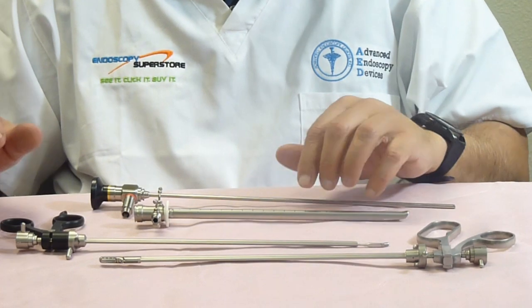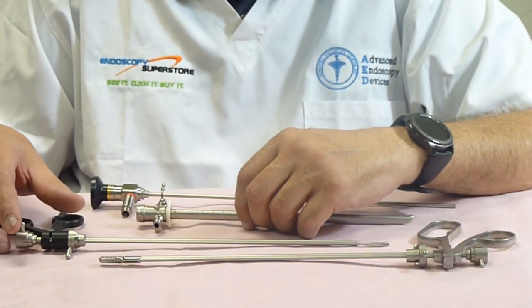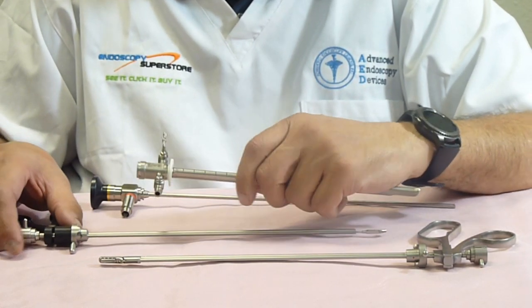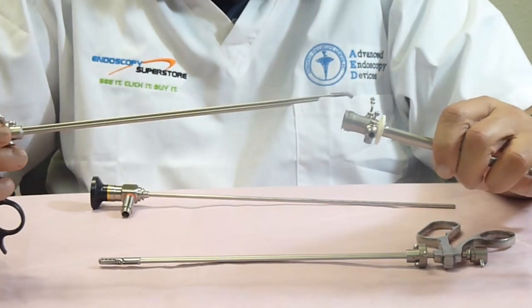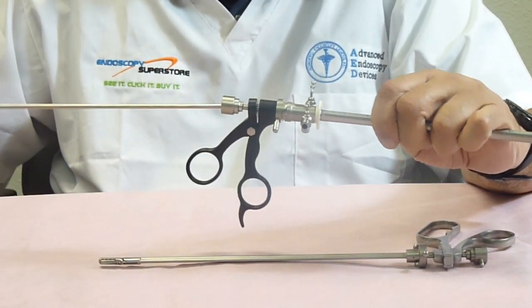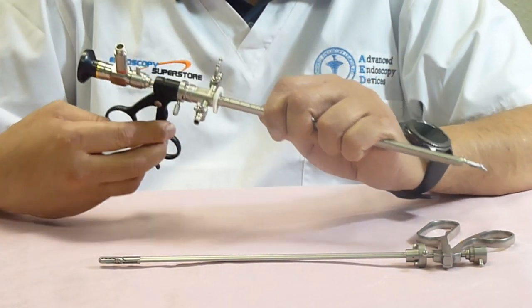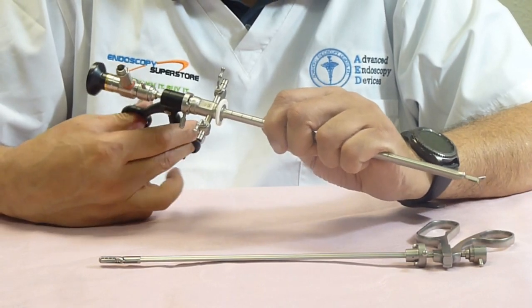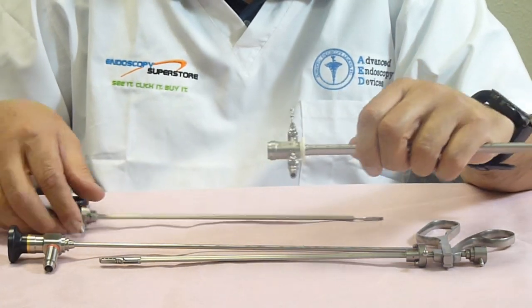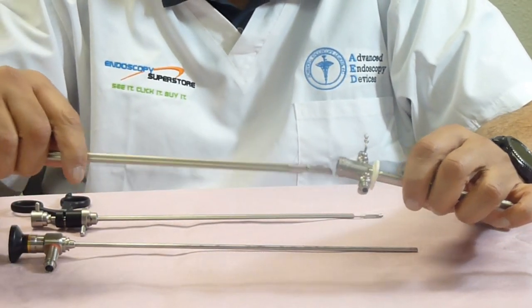Now there may come a time that you need something more aggressive than a flexible forcep — to grab a stent that's lodged in, or to break up some bladder stones. We have optical forceps that lock straight into our system, and then the scope locks straight into it. The reason they're called optical forceps is that you're able to view straight through the forceps and then grasp whatever you want to grasp.